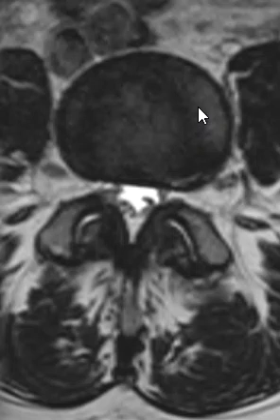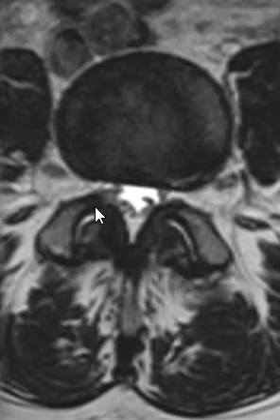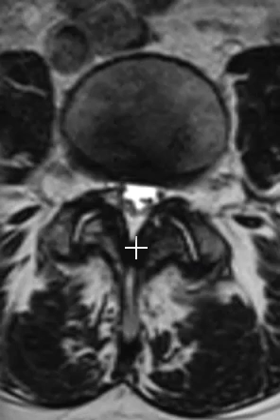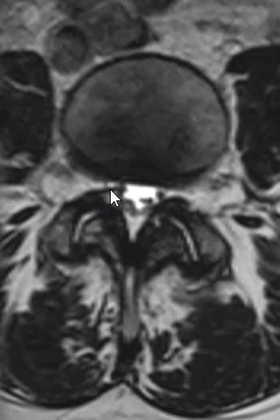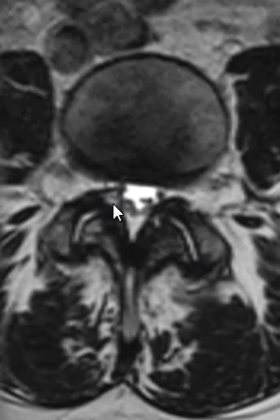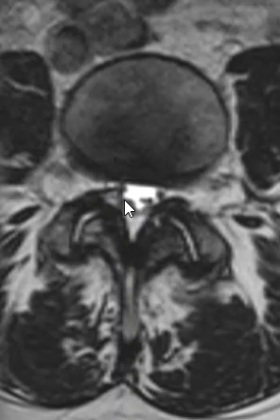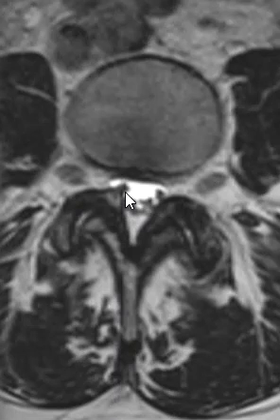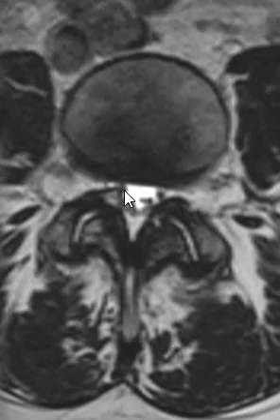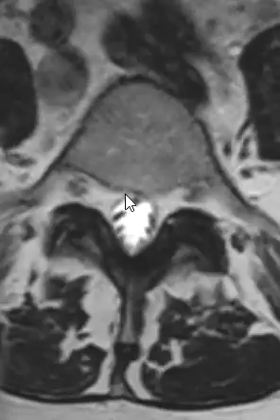Going down to the L4-5 disc level, which had the bulging disc, we see a little annular fissure on the left. The facet joints here are too large and arthritic. There's also a small round bright area — brightness indicating fluid — which is a synovial cyst coming off the facet joint. This synovial cyst is pinching a nerve, visible as a small dot, and the spinal canal is mildly narrowed. A nerve is also being pinched on the right side, which may explain the patient's pain.